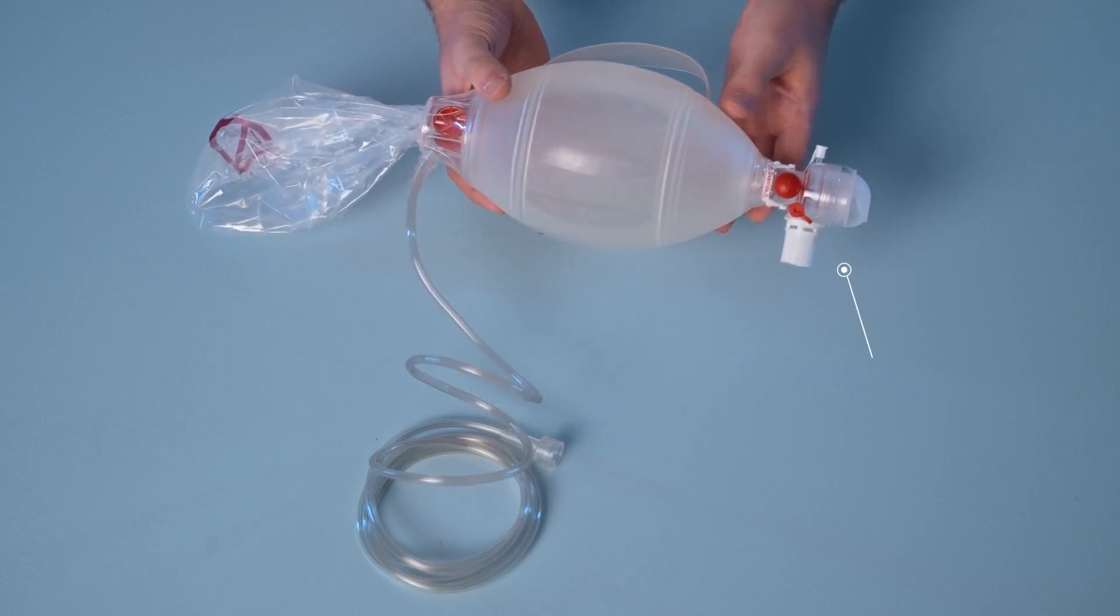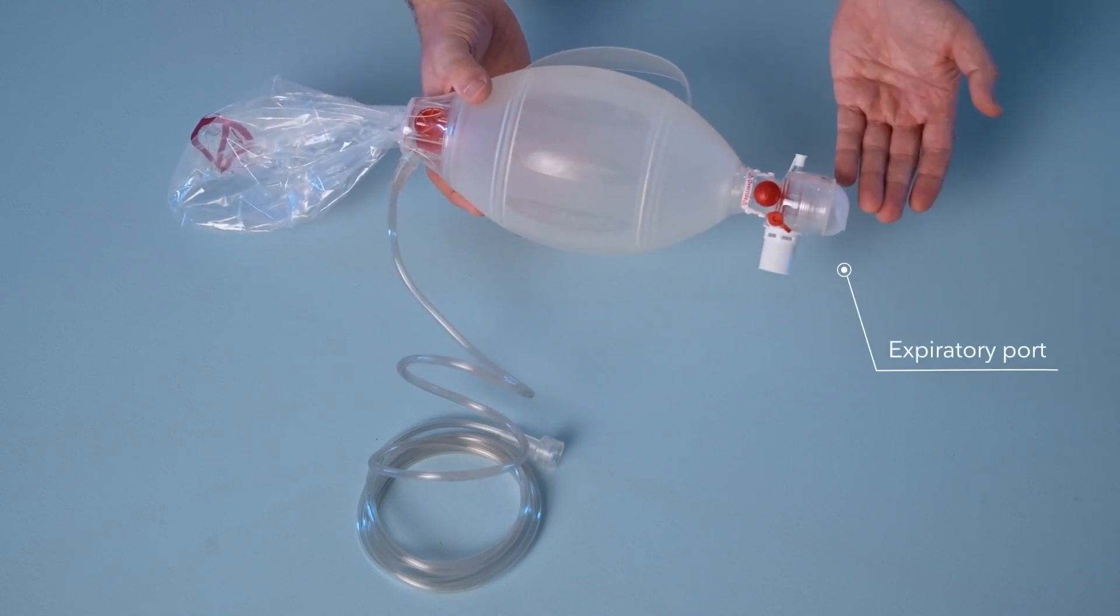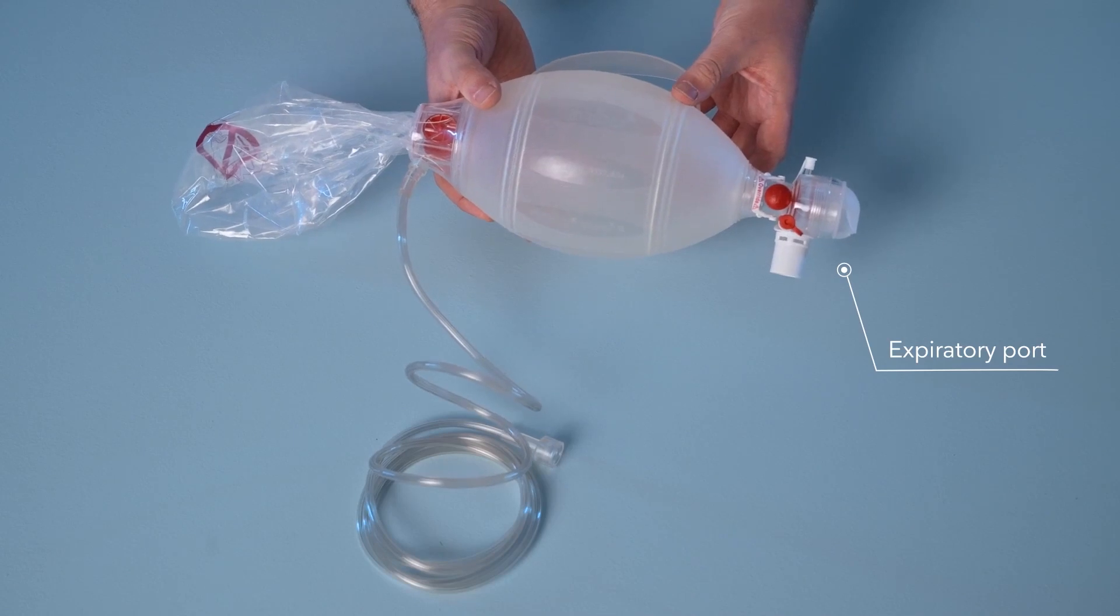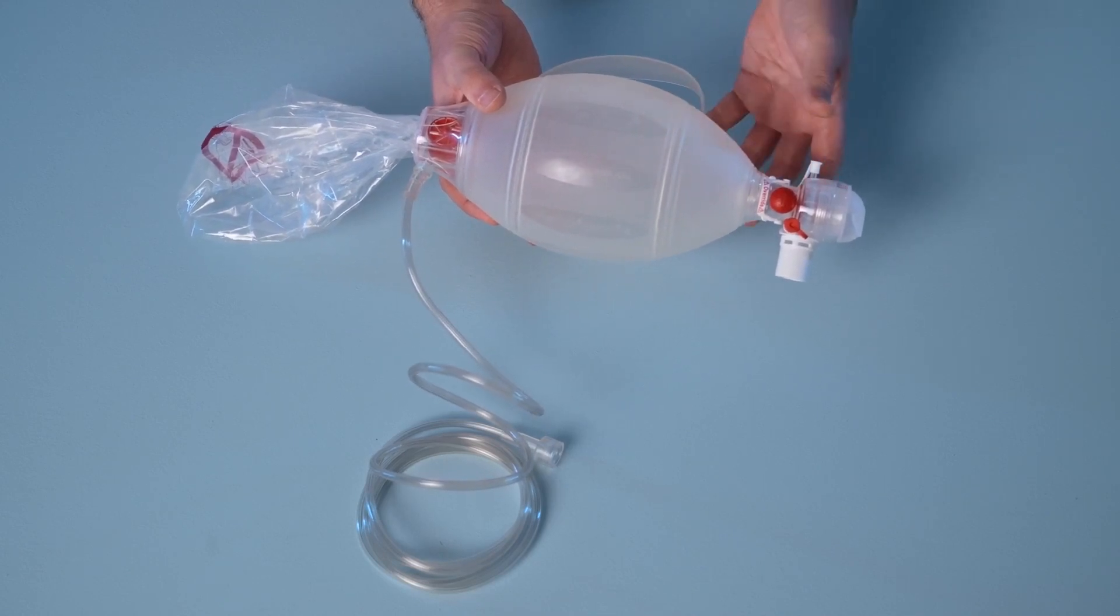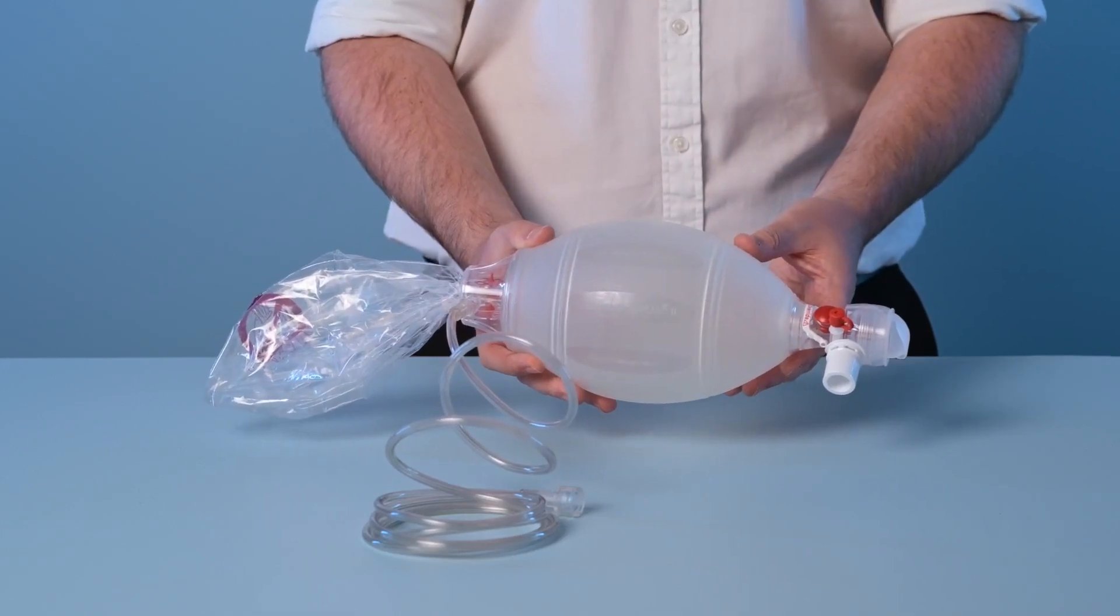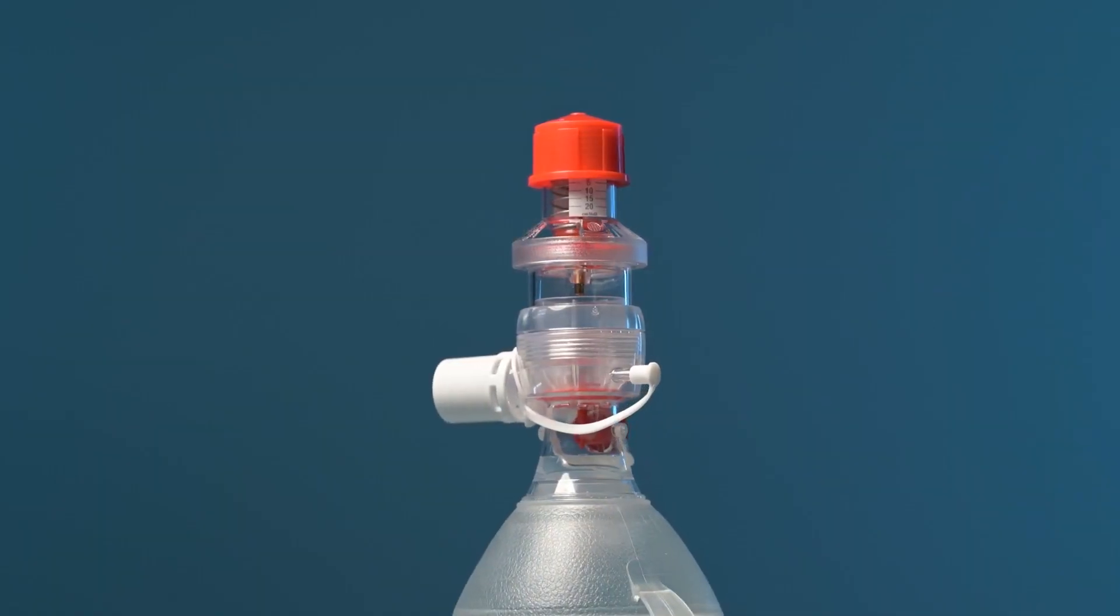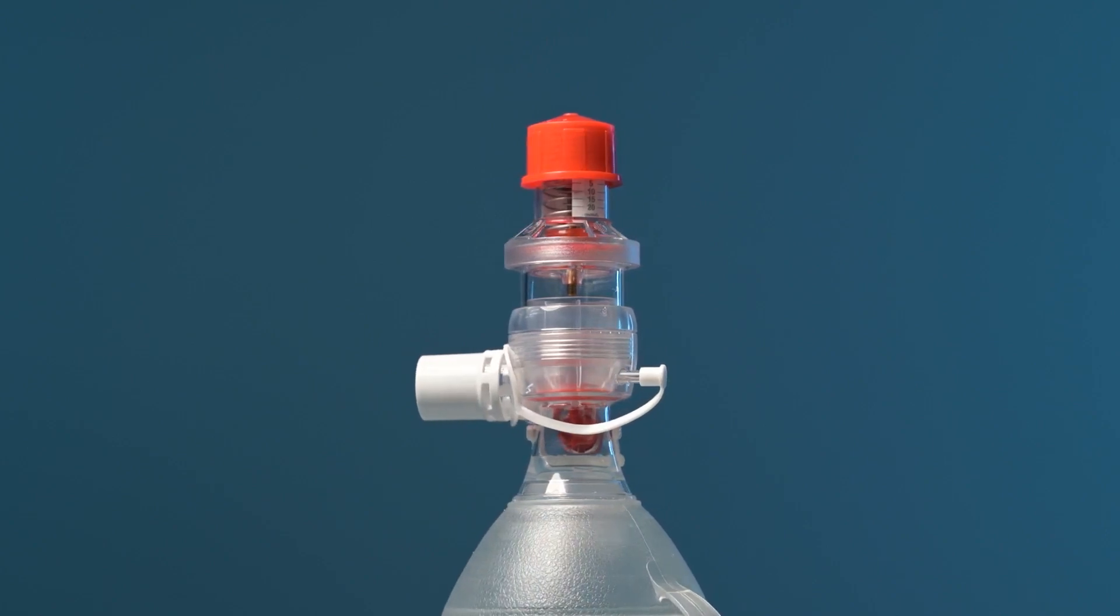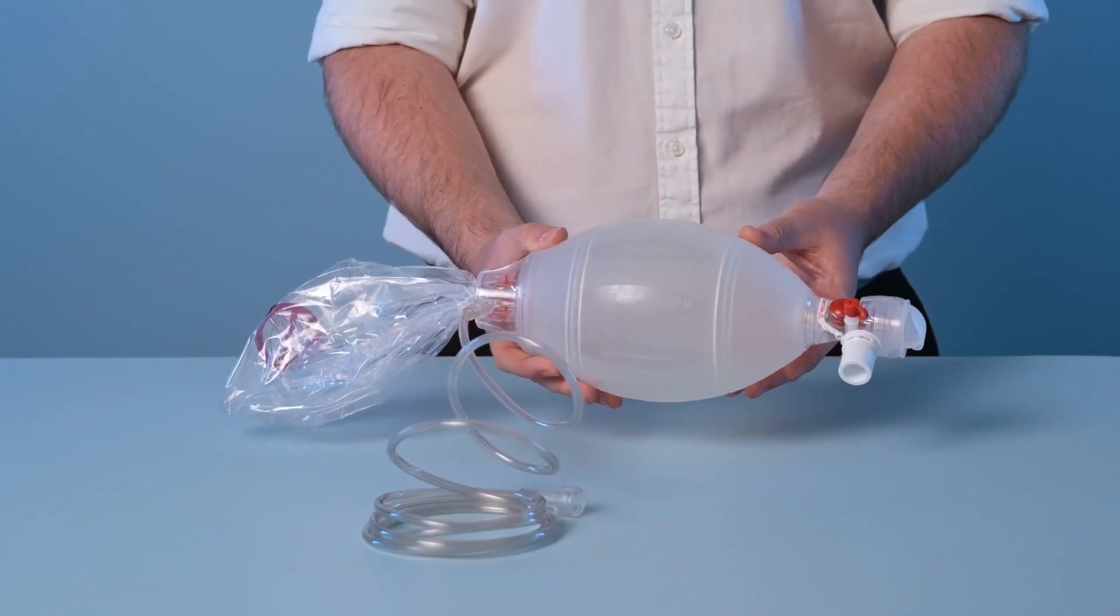Finally looking at the expiratory port, this is where a splash guard is located, and this has the function of directing patient exhalations and fluids away from the user. The splash guard may be replaced with an Ambu PEEP valve if required, and this does not require the use of a separate adapter.